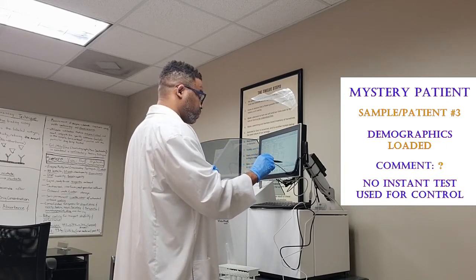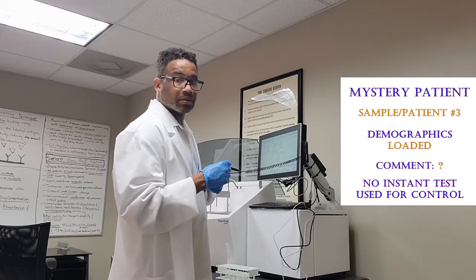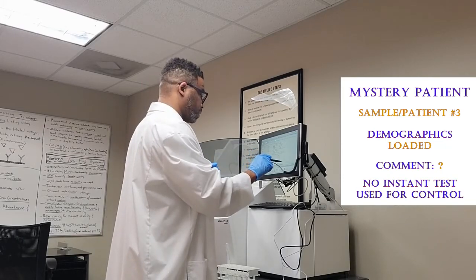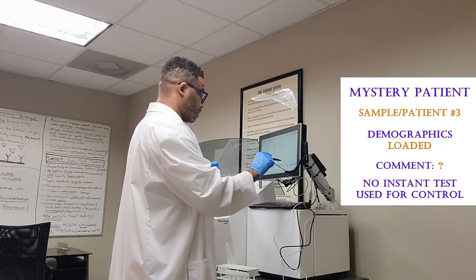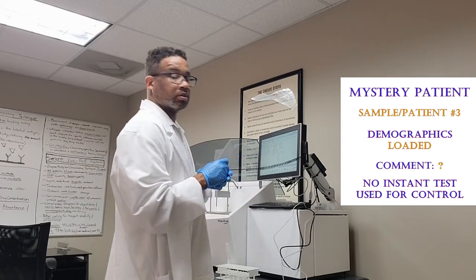Benzos are negative. AM, which is our amphetamine, is negative. 6 AM is negative. Buprenorphine is positive, so this person is in medical assisted treatment because they have a drug to help them wean off of their other drugs. Oxys are negative, have a healthy creatinine level, and a negative for fentanyl.